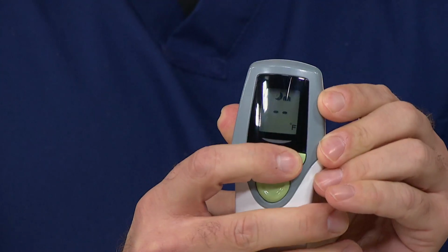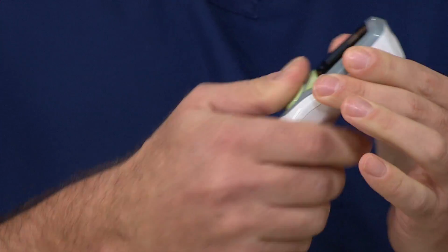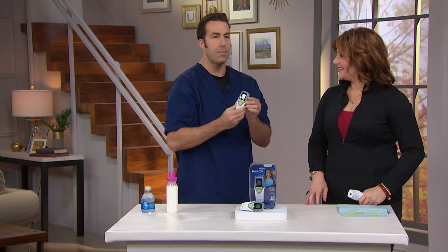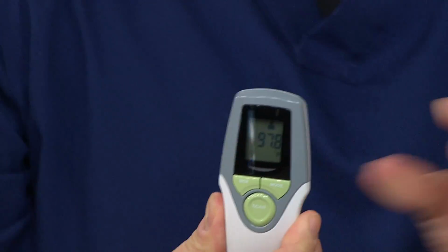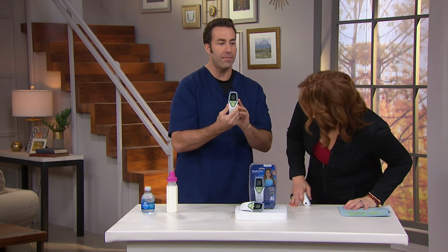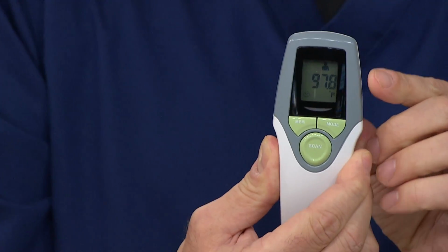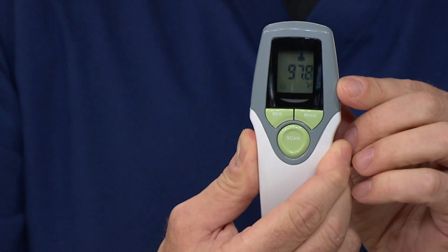This has a few modes on it, and I had it on object mode, which we're gonna go through. So there we go right here. I'm gonna go ahead and check Robin's temperature. Okay, you hear the beep. Am I normal? Well, that's debatable. Ouch! Clinically accurate result, live TV, okay, 97.8. I am normal. You are normal, temperature-wise. And you see on the display here, Robin, that we have a smiley face, okay? That's telling us that we're in the clinically desired zone.